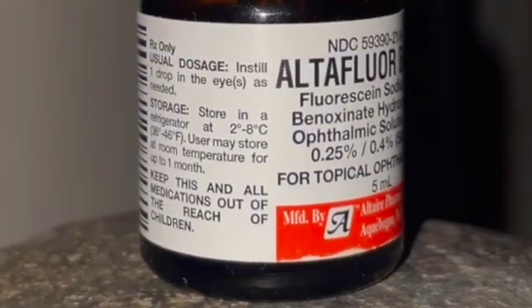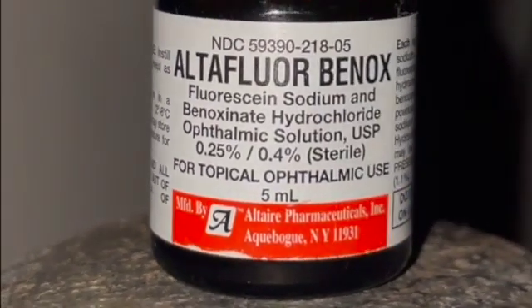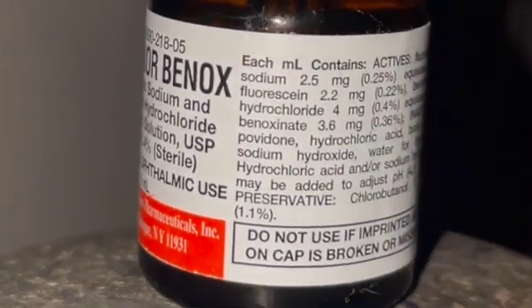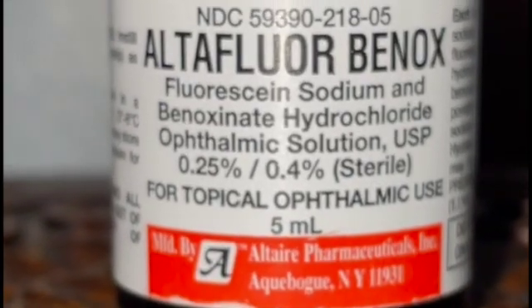You also want to have this second most important item that's different from the actual metal tools. It's more of a protective item. This is one material you don't want to forget. You actually can't do any eye procedure without this guy. This is the lifesaver because it's not only preventing the pain, it also cleans and reduces infection and bleeding from the invasive procedure.